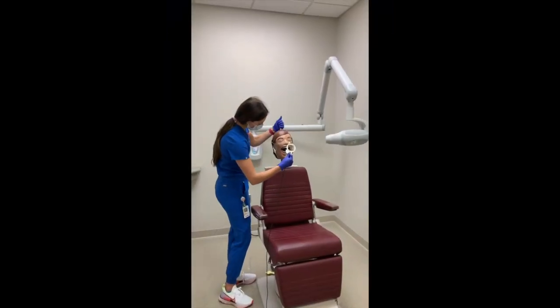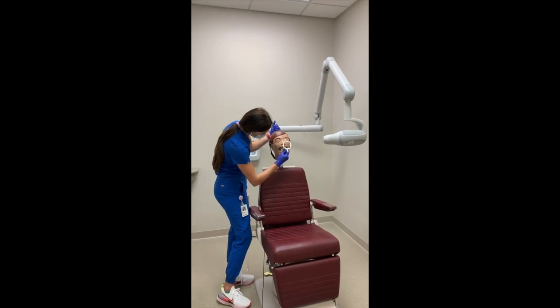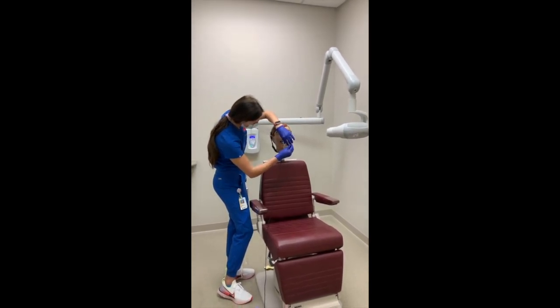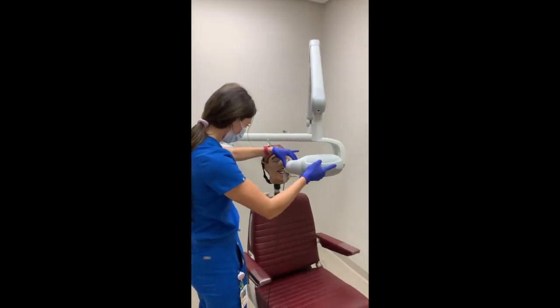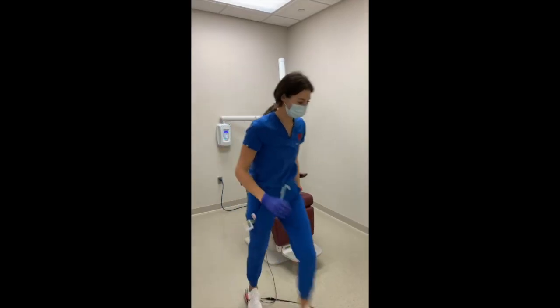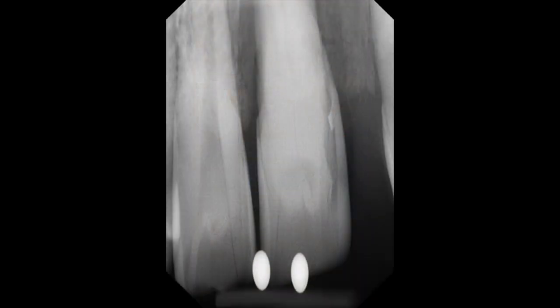In our second example, the student is attempting to capture a PA of the maxillary central incisors. The student places the anterior PA setup using the paralleling technique. This patient, however, closes too hard on the biting block. This opens up the angulation between the sensor and bite block greater than 90 degrees, flattening it against the hard palate. The resulting image reveals the maxillary central incisors as elongated, with missing root apices.